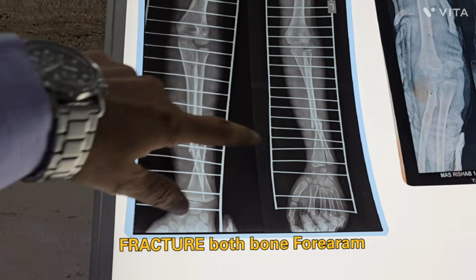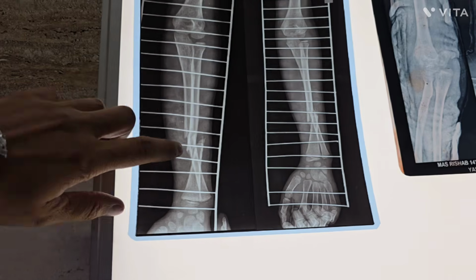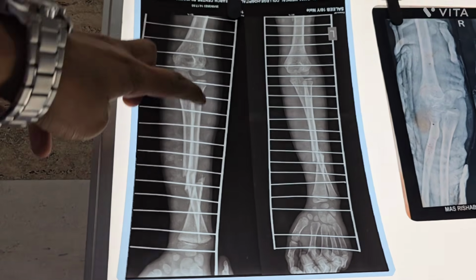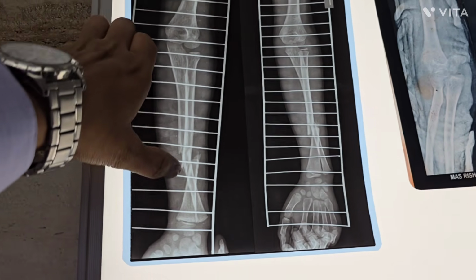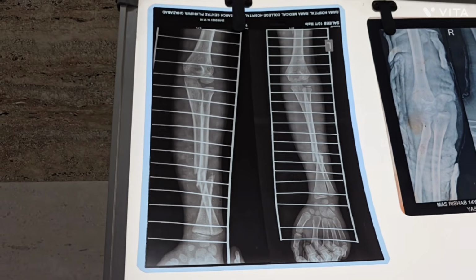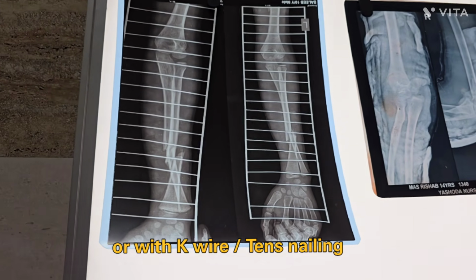In this X-ray you can see a distal 1/3 both bone forearm fracture. So what are we going to do in this case? Firstly you immobilize with the Kramer wire. Then after the pre-op preparation, you can do closed reduction with slab fixation, or otherwise you can do closed reduction with internal fixation with K-wire or TEN nail. So these are the options.